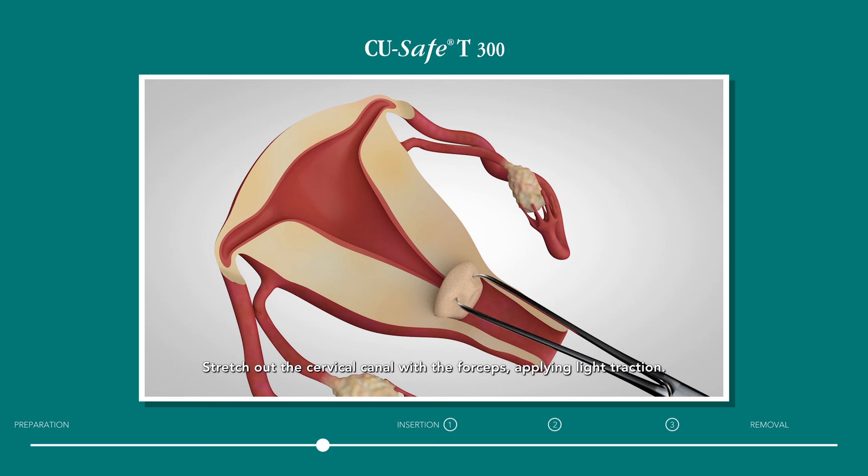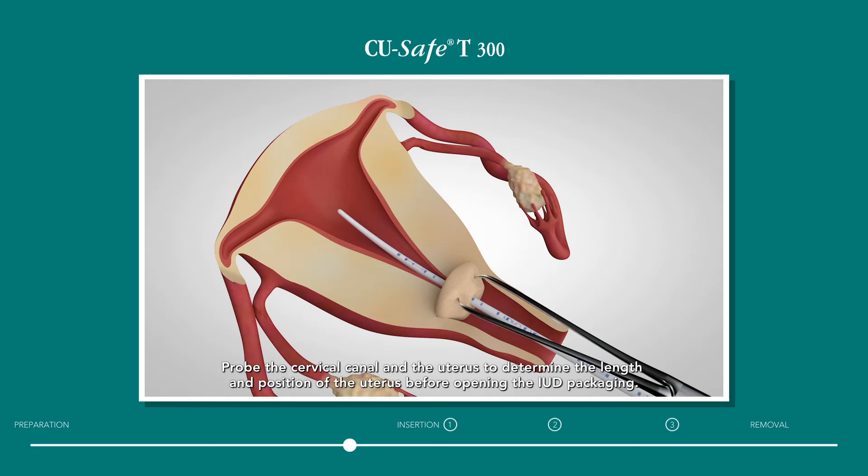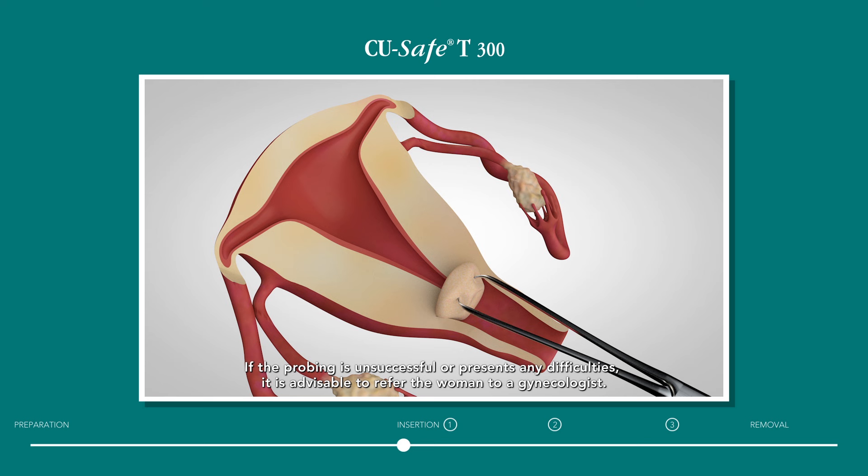Stretch out the cervical canal with the forceps, applying light traction. Probe the cervical canal and the uterus to determine the length and position of the uterus before opening the IUD packaging. If the probing is unsuccessful or presents any difficulties, it is advisable to refer the woman to a gynecologist.